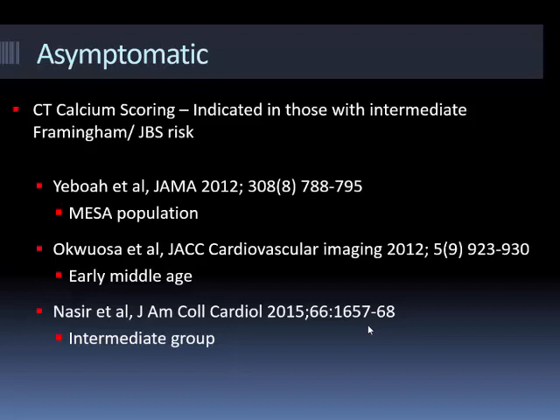By using calcium score, you can potentially identify a group that's of higher risk. And I draw your attention to this paper, which has recently come out, which basically looked at reclassification of people who are in the intermediate risk. And they found that if you apply the reclassification as recommended by the AHA now, you effectively double the number of patients who would require statins compared to who are receiving at the moment.